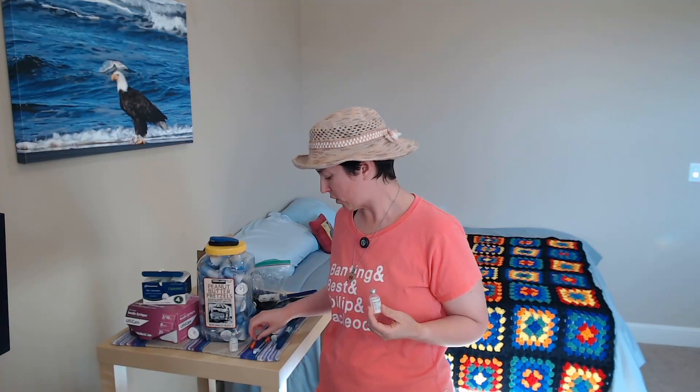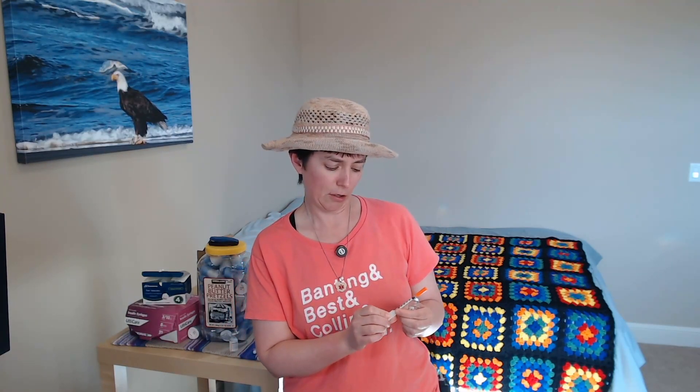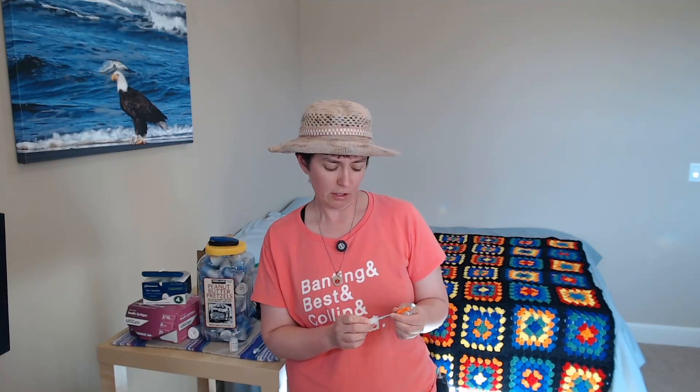When I was first prescribed insulin, I was prescribed it in a vial by my primary care physician, and she also prescribed insulin syringes, which you do need if you're going to be dosing from a vial. Insulin syringes come in many different sizes, and my doctor actually prescribed one that was too big. She prescribed ones that could hold 100 units, but I was only dosing like three units, so it was very difficult.